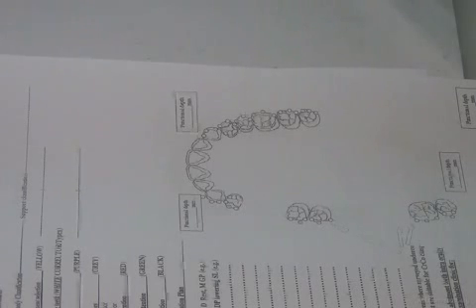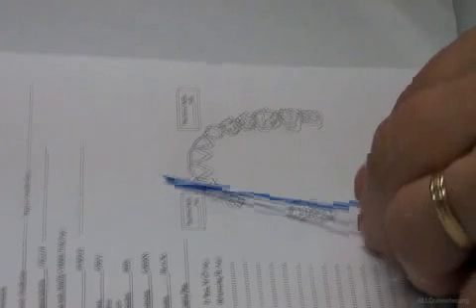Do I need to add components here? Why? We have 2 reasons to add. Either because of indirect retention or because of cross-arch stabilization. What do I need here? I need both. So, I need indirect retention because this is my principal fulcrum line between these 2 rests. So I have to extend somewhere here. And I need cross-arch stabilization.